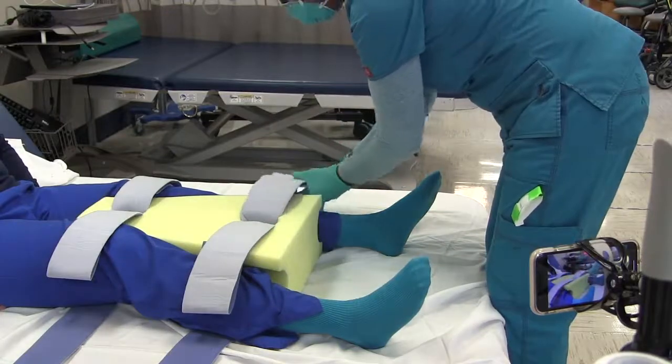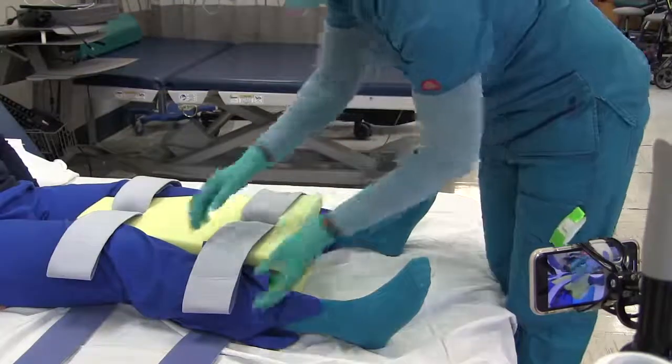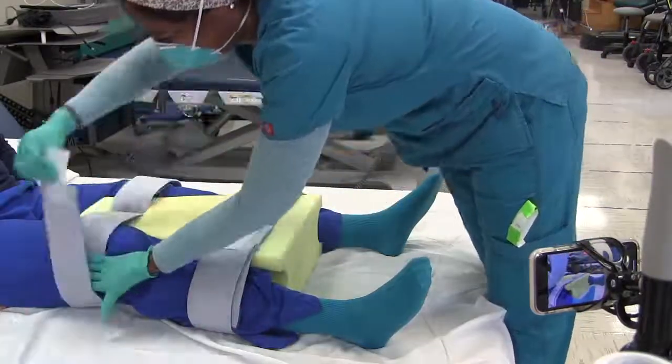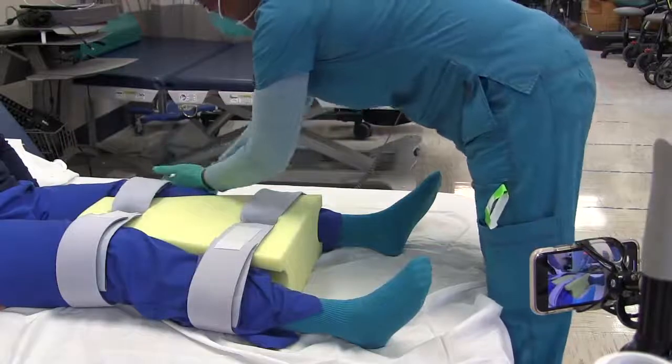The straps should be fastened so that they are comfortable for the patient. Put your hand under so you have a little space between the strap and the patient's leg.